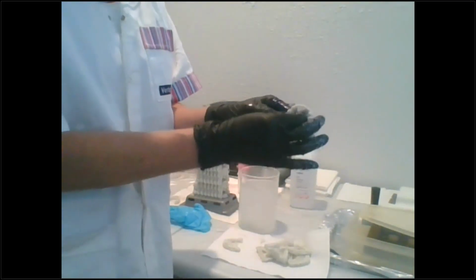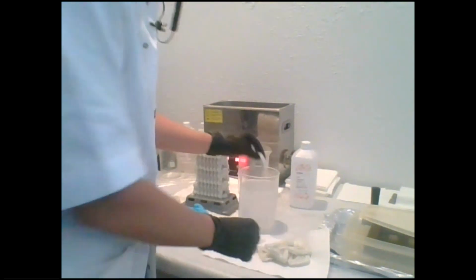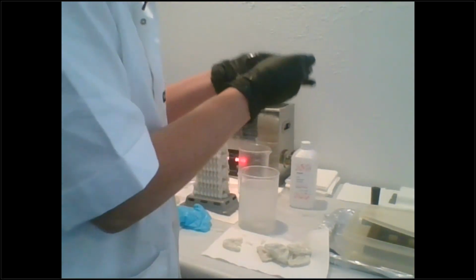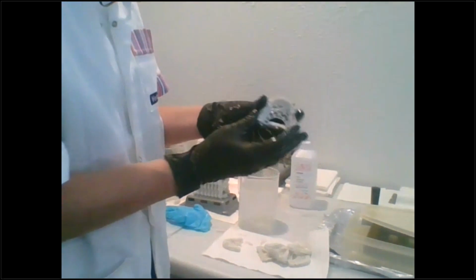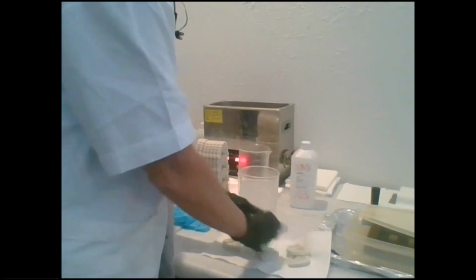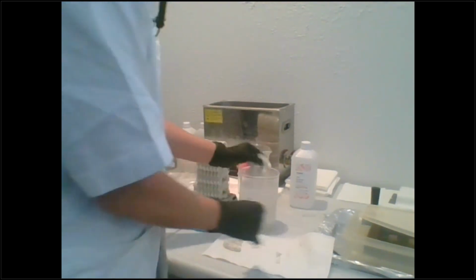Okay. And they come off with literally no scarring. It's just such a fine tip that is holding those stable, those incisal edges and the mesial and distal edges, which sometimes curve a little bit. And so we wanted to make sure that there was maximum accuracy all the way across the board. Okay, so again, I'm just going to do that and put this into your ultrasonic for 3 minutes, okay?